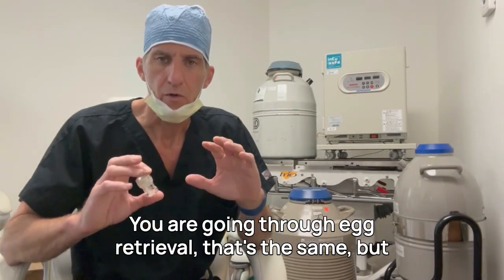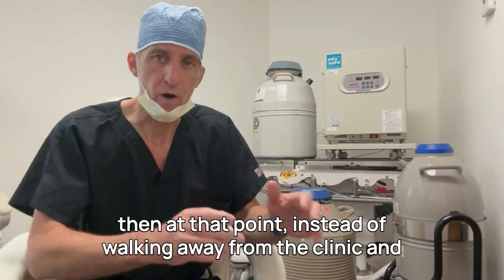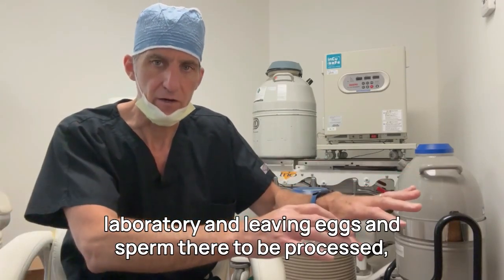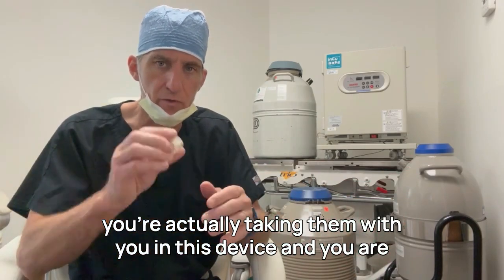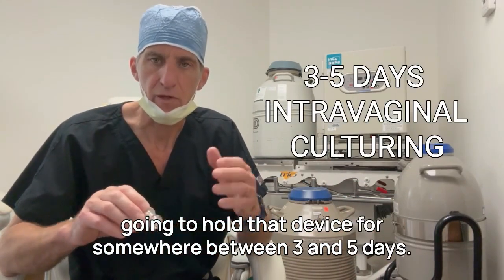You are going through egg retrieval, that's the same, but then at that point, instead of walking away from the clinic and laboratory and leaving eggs and sperm there to be processed, you're actually taking them with you in this device, and you are going to hold that device for somewhere between 3 and 5 days.